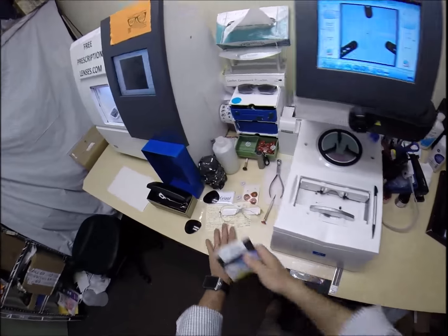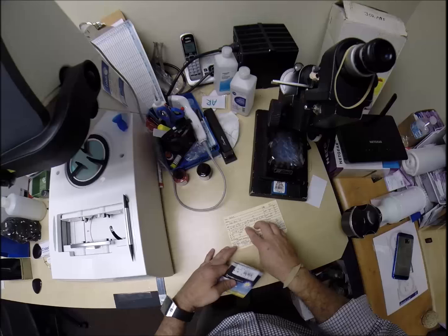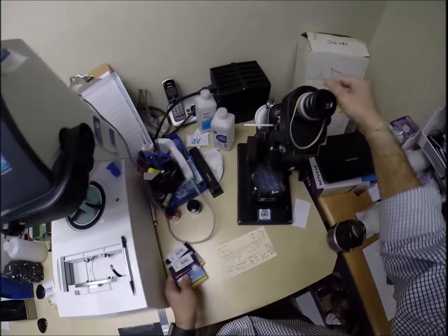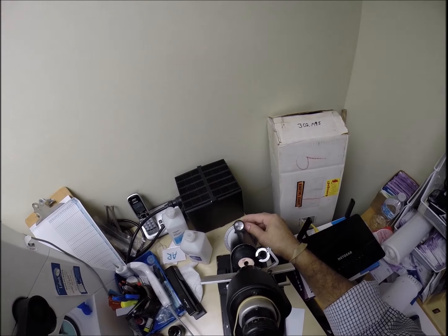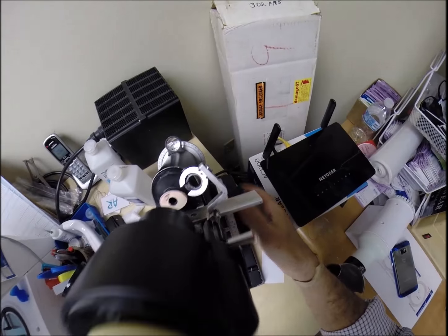Let's come down here to the lensometer. Your right eye reads +1/4 -1 1/4 at 165. This one +1/4 -1 1/4 at 165. It was already on there from the last one I did. How about that? I love it when that happens.